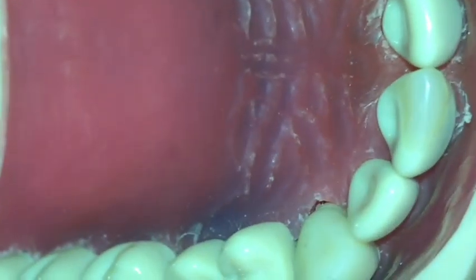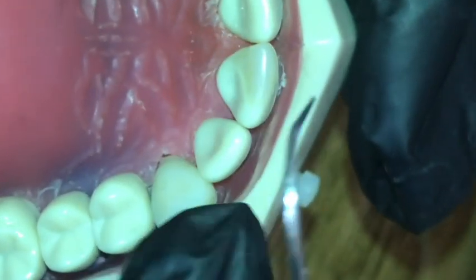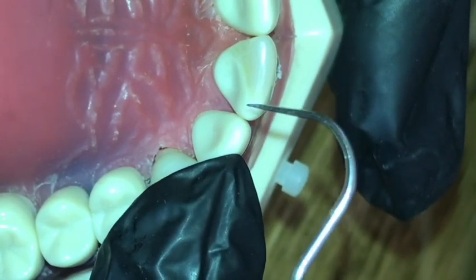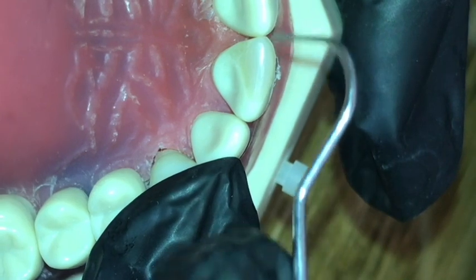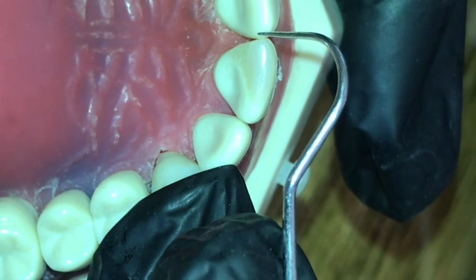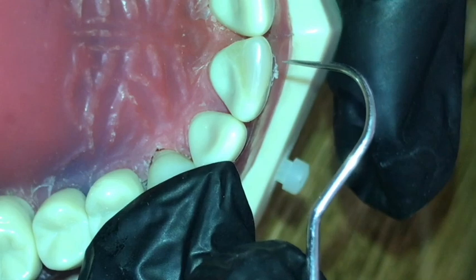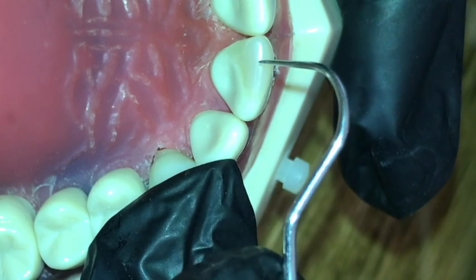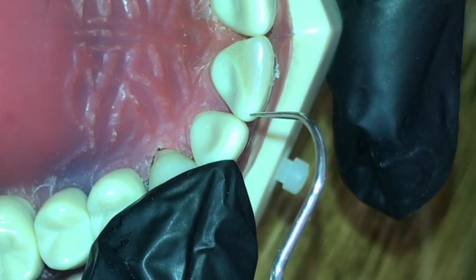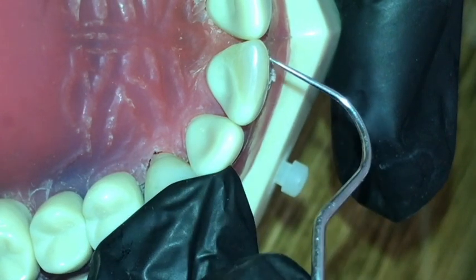Looking at your restoration from an occlusal view, probably the most important side to assess your Class 4 composite restoration. First of all, the incisal edge of your restoration should be at the same level with the adjacent and at the same level with the rest of the incisal edge. You see that light reflection? This gives you an idea where your incisal edge is. So it should be at the same level with the adjacent and the same tooth.